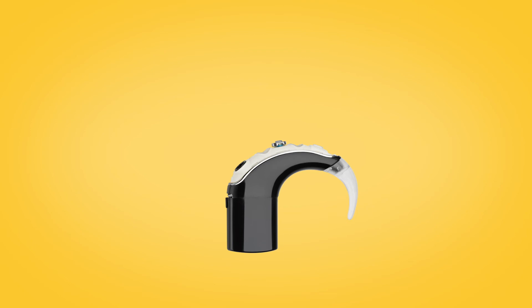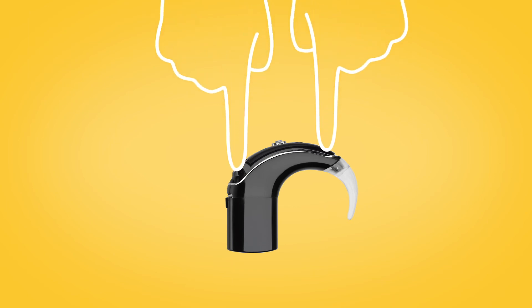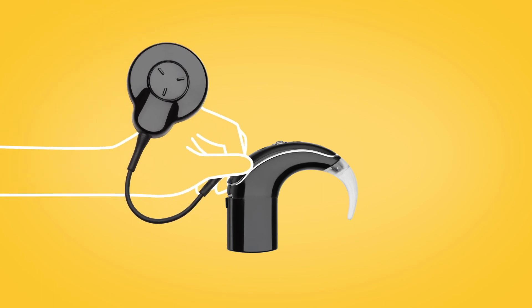To insert the new microphone cover, fit the replacement onto the sound processor and press down firmly with a finger on each end until you feel a click. Lastly, without twisting, push your coil cable onto the sound processor until it clicks.